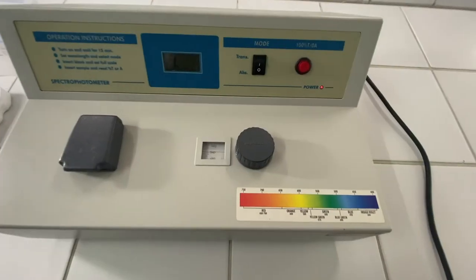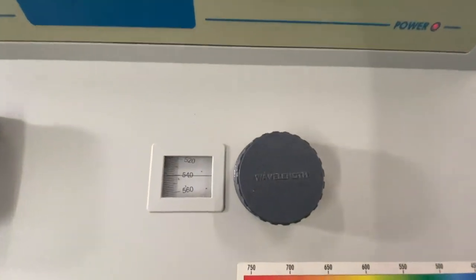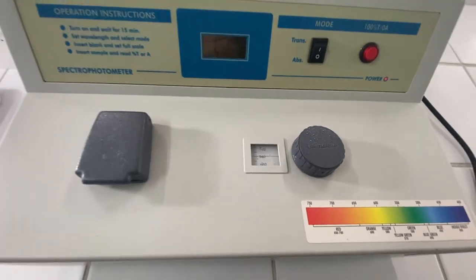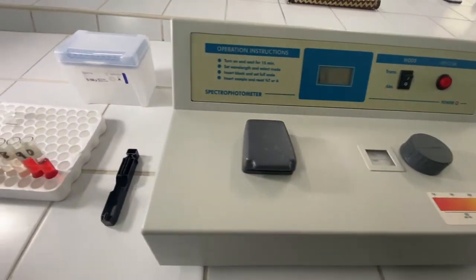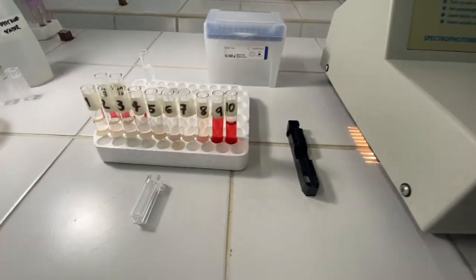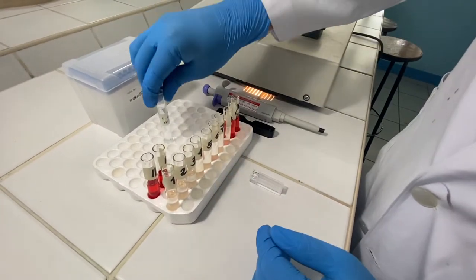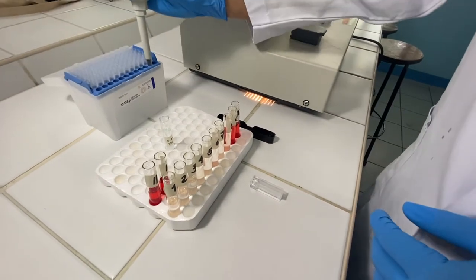Next, read the absorbance of the different supernatants at 540 nanometers using a spectrophotometer. Use the 0.85% sodium chloride solution without blood as your blank.